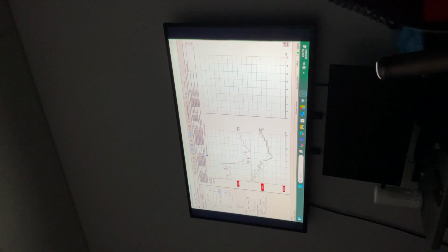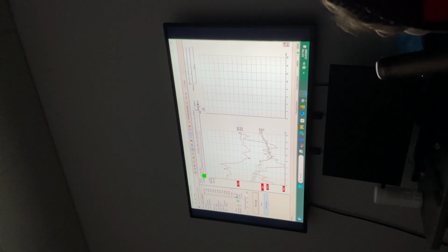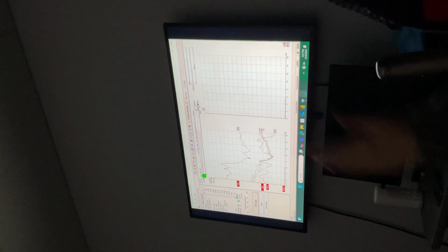Why is it showing the green normative bar? It's off, so ignore that. It doesn't show it for the other ones. Earlier, I think something is off. When we were doing click, it never showed up once. The green, yeah, that's the normative data.